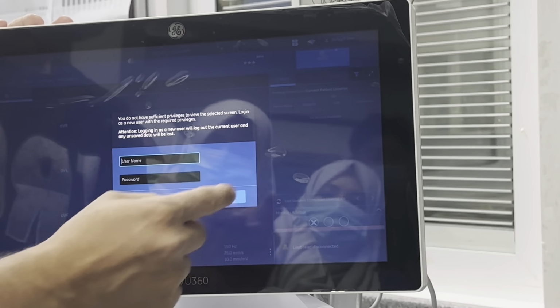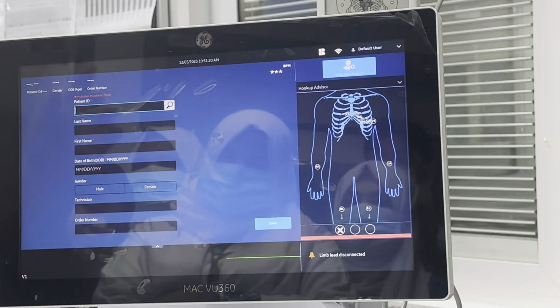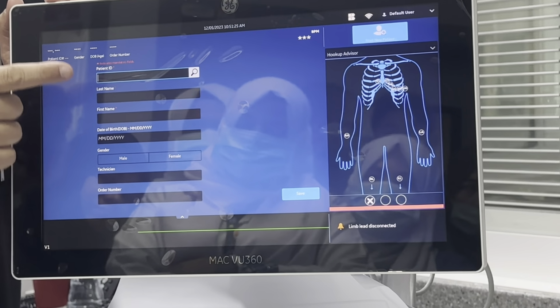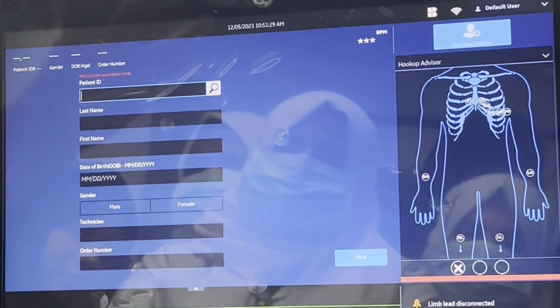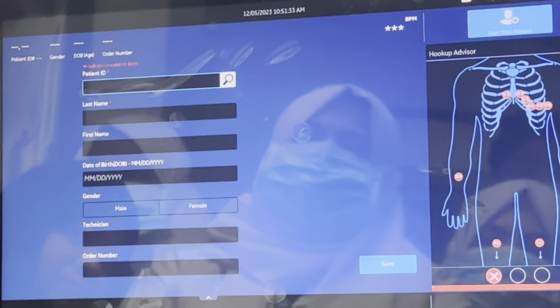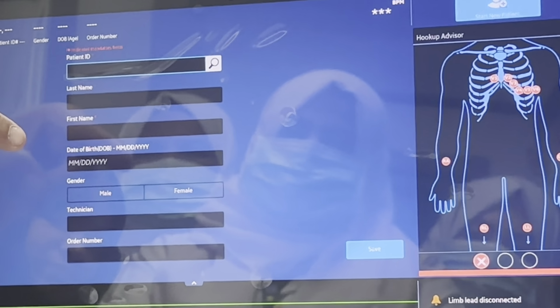Sorry, before I do that. So we said that we will acquire the ECG for our patient. We will retrieve all patient information. So here in your patient information, you can find 3 red stars. These are mandatory fields for transmitting. They will not be mandatory fields for acquiring. So it will not stop you acquiring an ECG, but it will stop you transmitting any rubbish to the system.